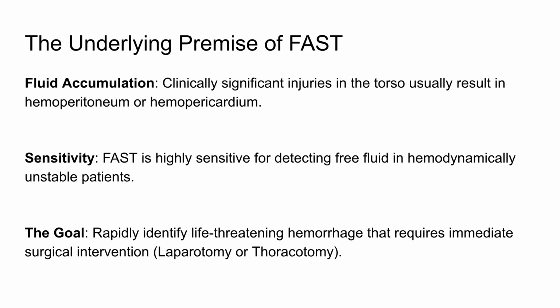The underlying premise is that significant torso injuries often cause hemoperitoneum or hemopericardium. FAST is highly sensitive for detecting free fluid in unstable patients. The goal is to rapidly identify life-threatening hemorrhage needing immediate surgical intervention.